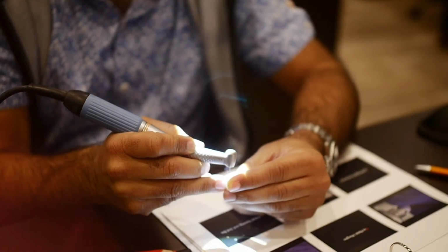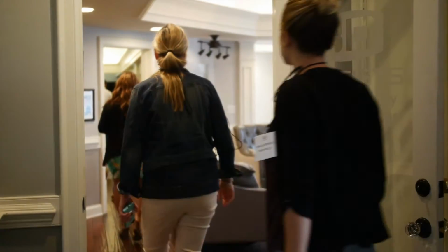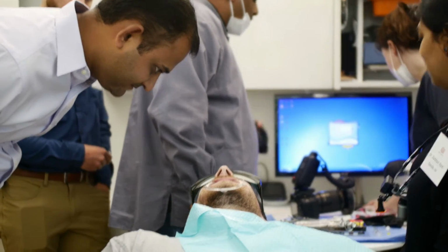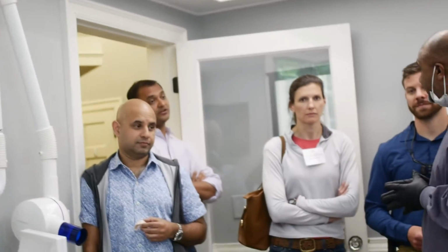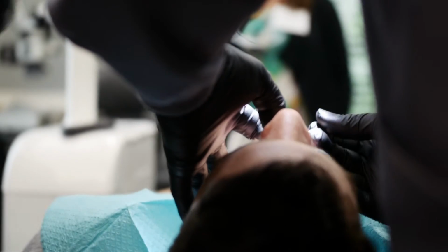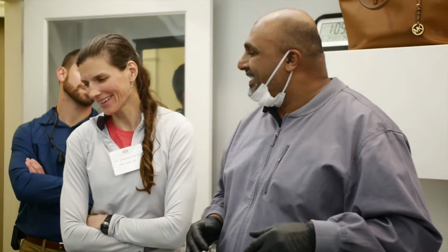You do your post-mill contouring based on all the learnings that you do on the first day and a half of the course. And then you apply all those learnings on the post-mill contouring, and you go ahead and get your case ready, and you pick from the 4 staining and glazing techniques that you learn, and you apply it on your live patient case. We bring the patient back and we try each one of their restorations on the patient, and we mutually decide which one is the best one.